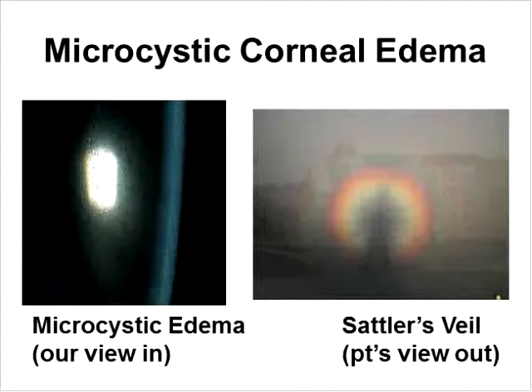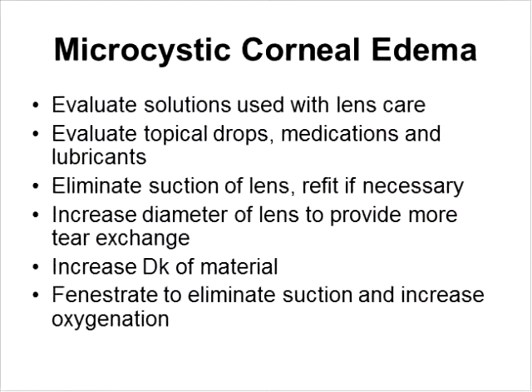And again, microcystic edema you always should be mindful of. It's best to be seen in indirect view. And the patient also will be noticing rainbows around lights and grayed vision. So it's helpful to just shine a light in their eye and ask them if they see rainbows after lens wear. And when you have microcystic edema, evaluate the solutions that they're using with lens care and their drops. They might be reacting to some preservative of some sort. You also want to make sure that the lens is not suctioning, and you must refit if necessary.